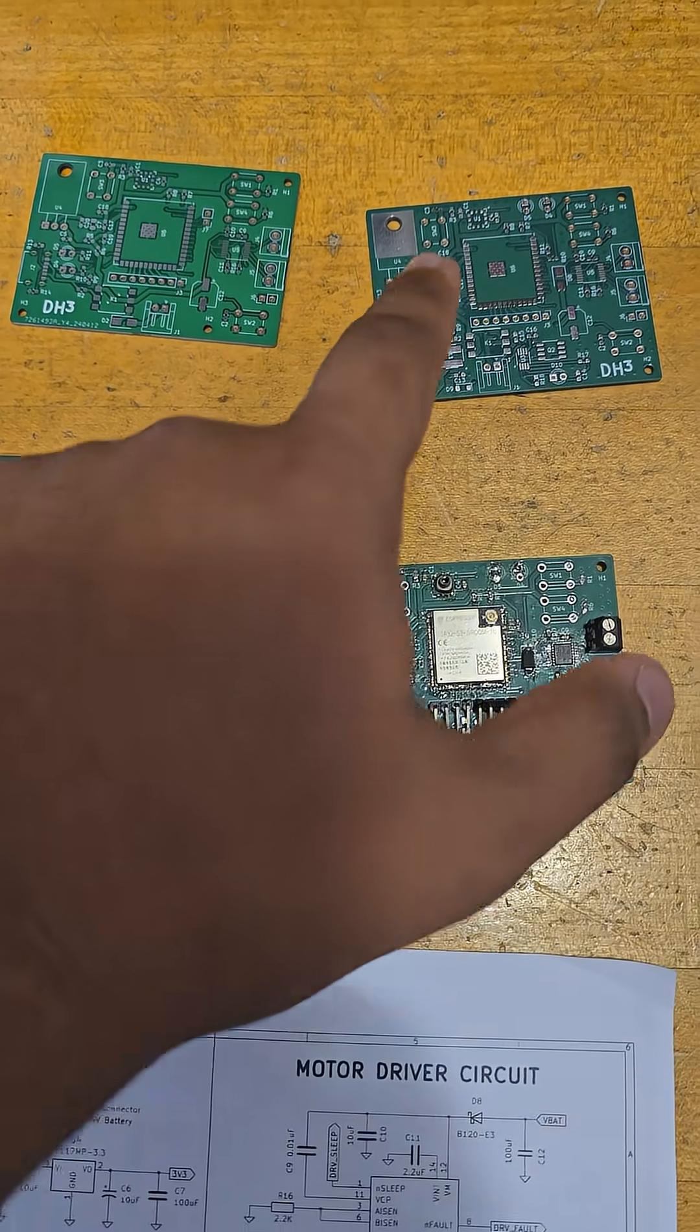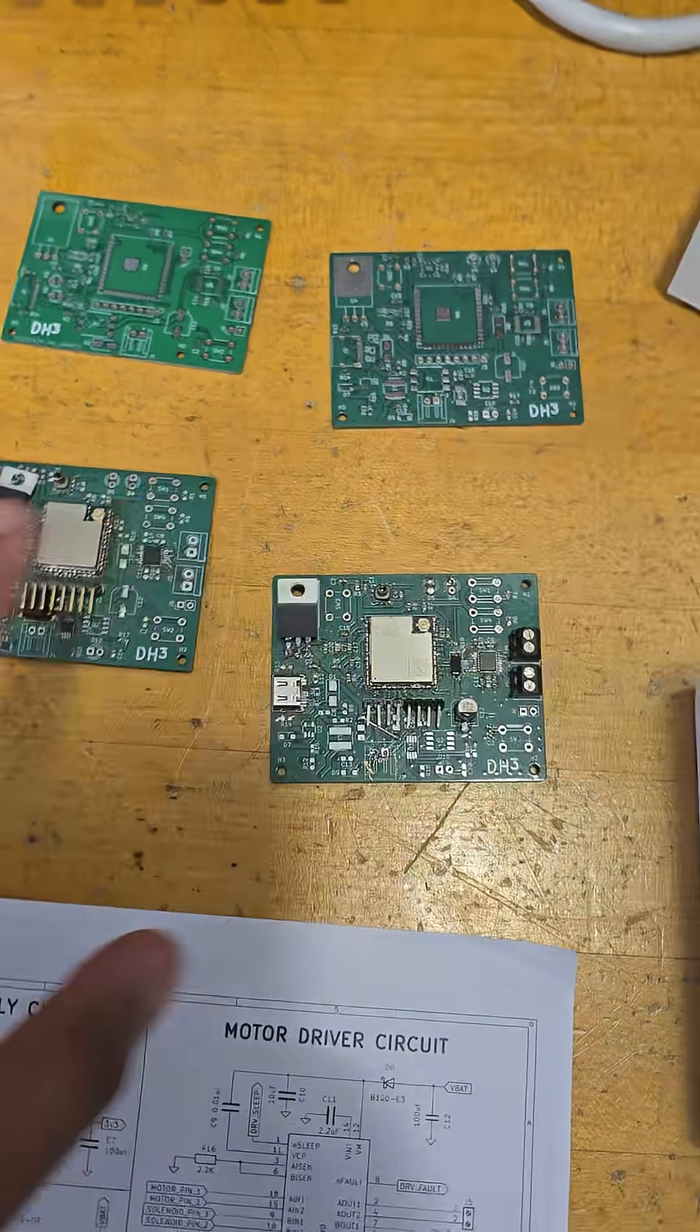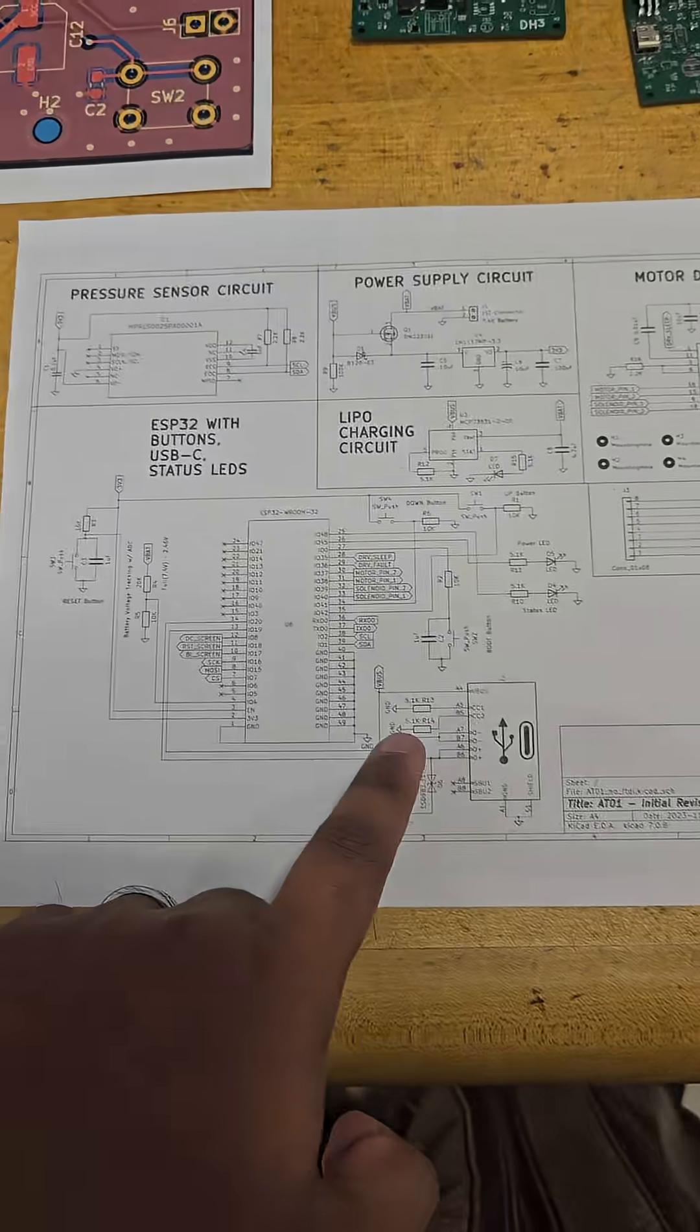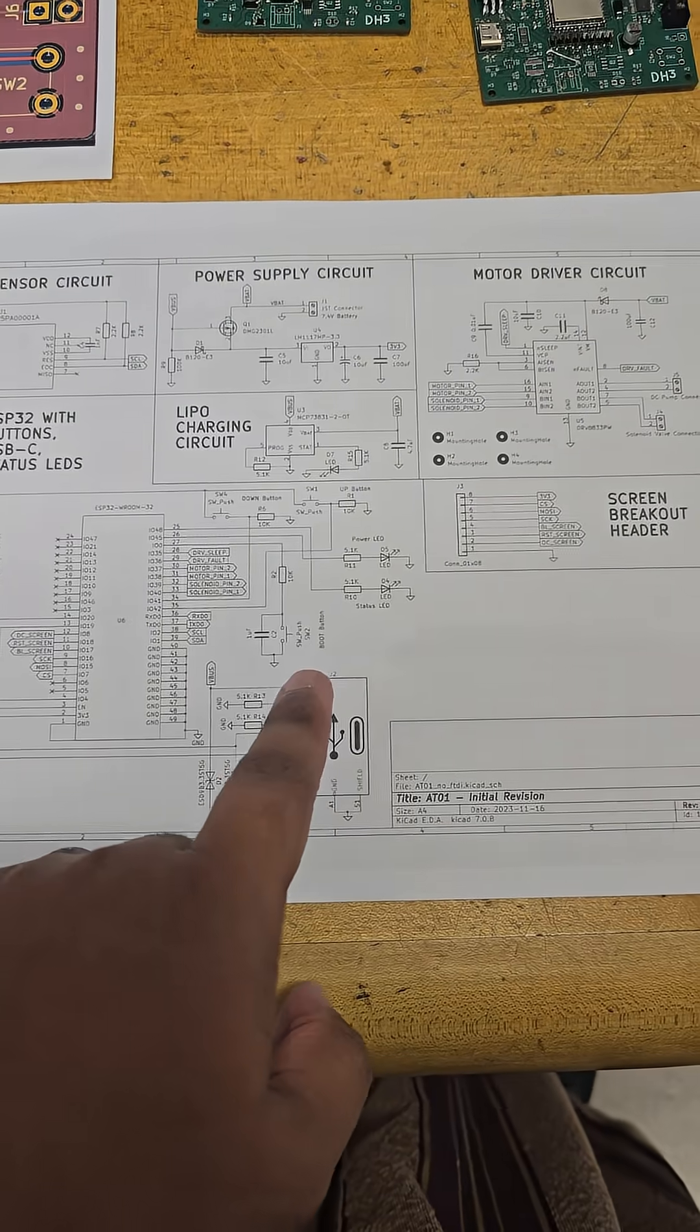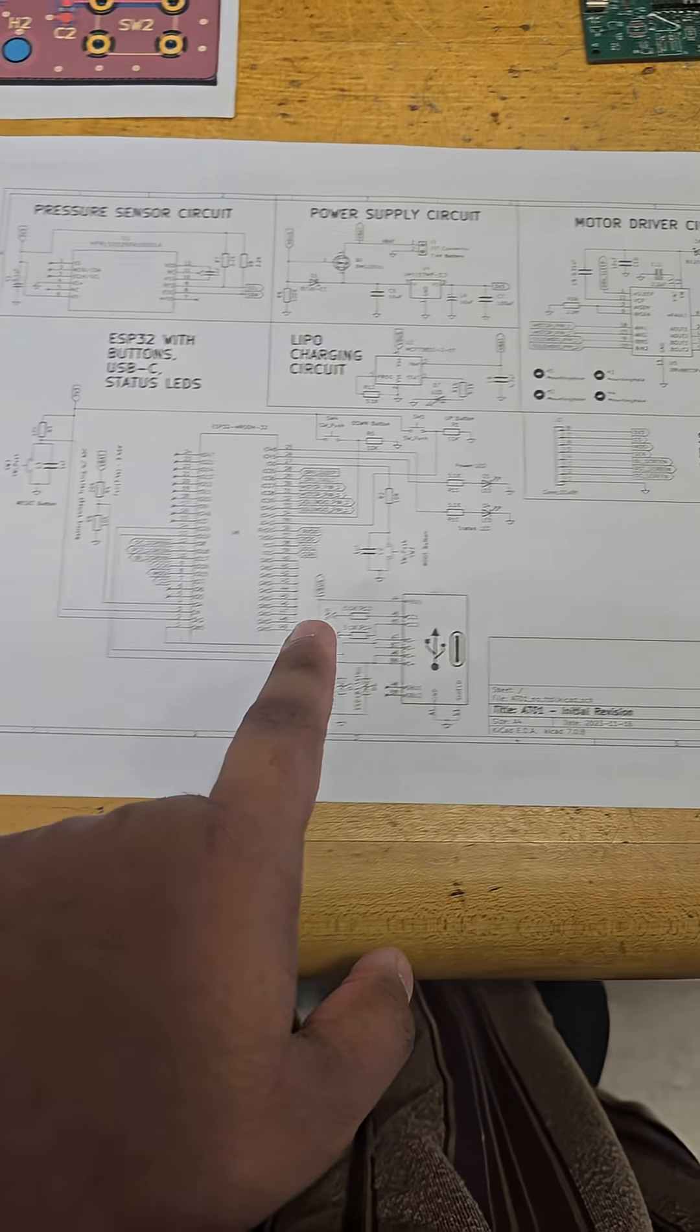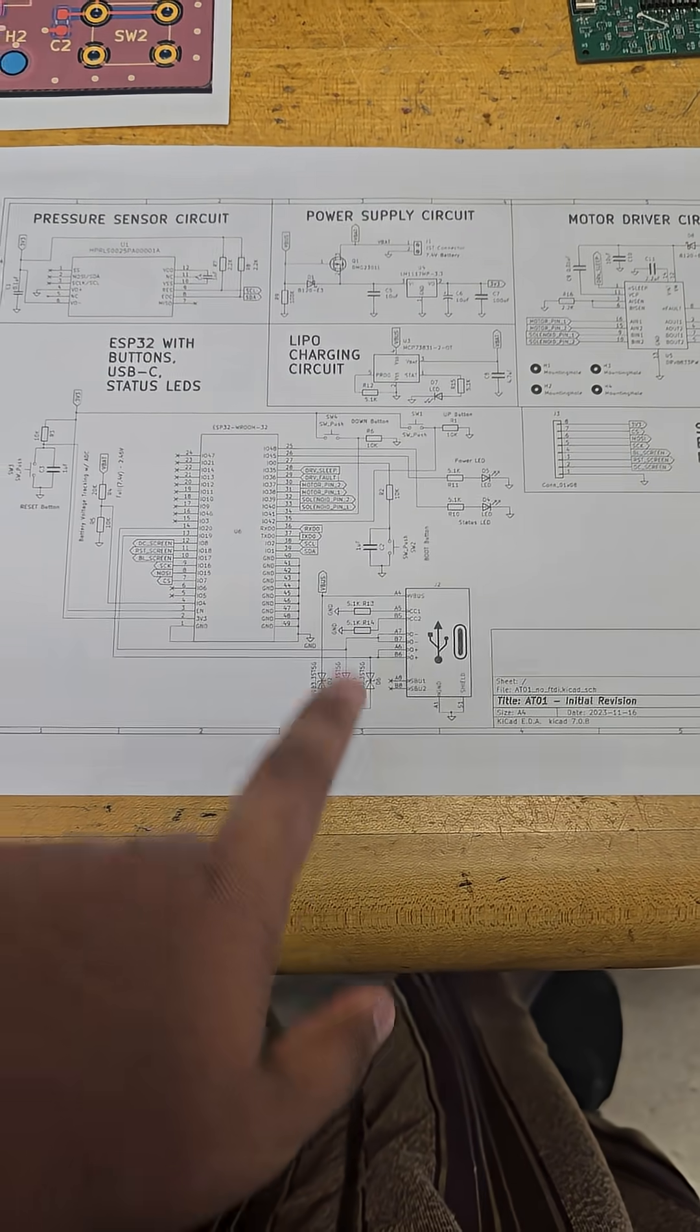This is the final version, and over here we have an initial iteration of our full schematic.